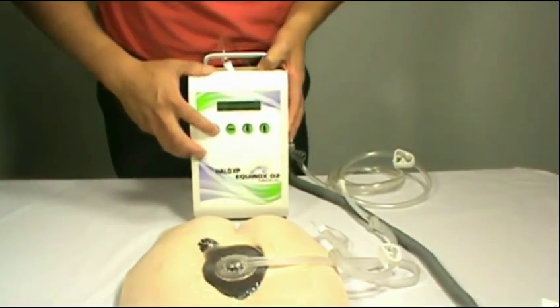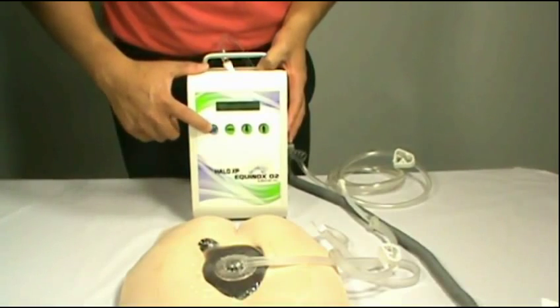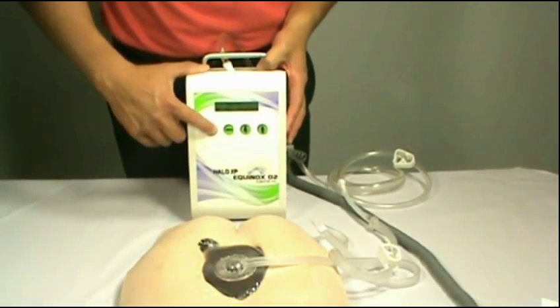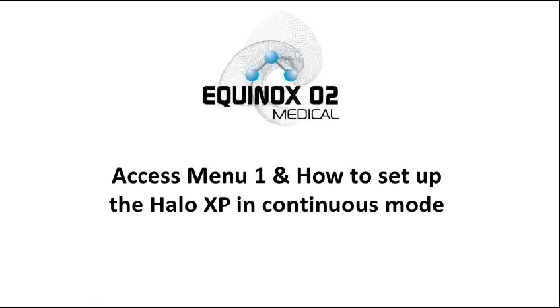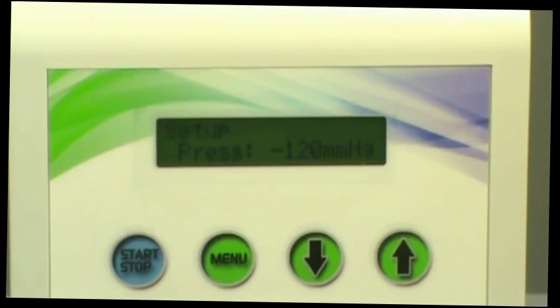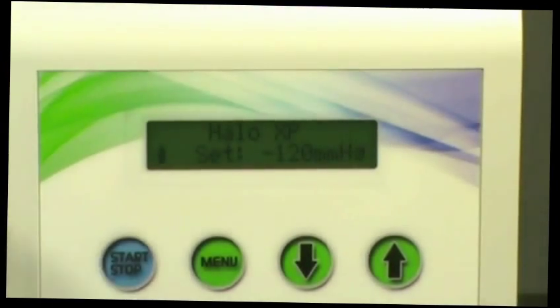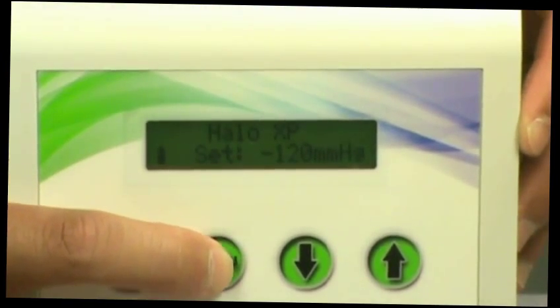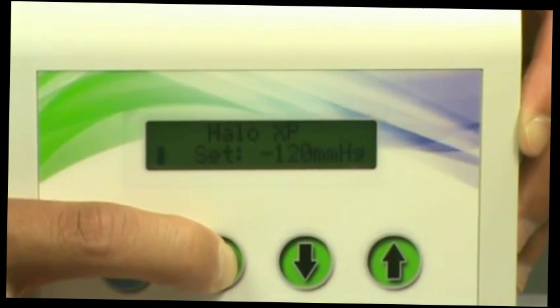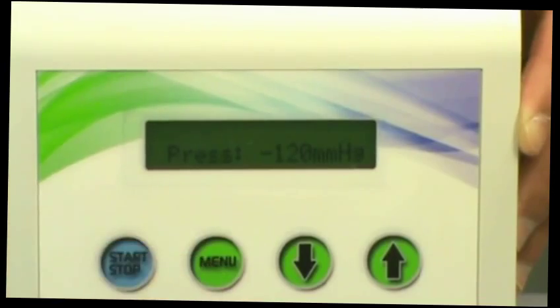Turn on the pump. And that's it. You will need to press the menu button and hold it for five seconds. This will allow you to access the first menu. Make sure you hear a beep.